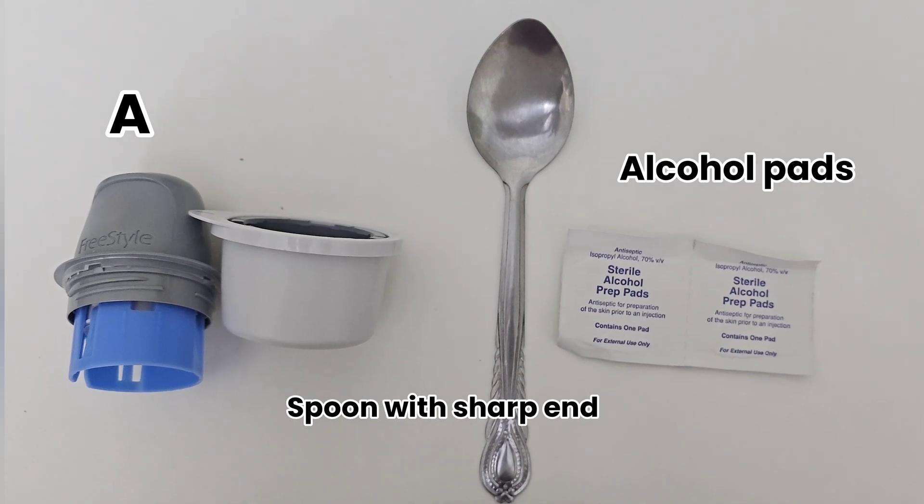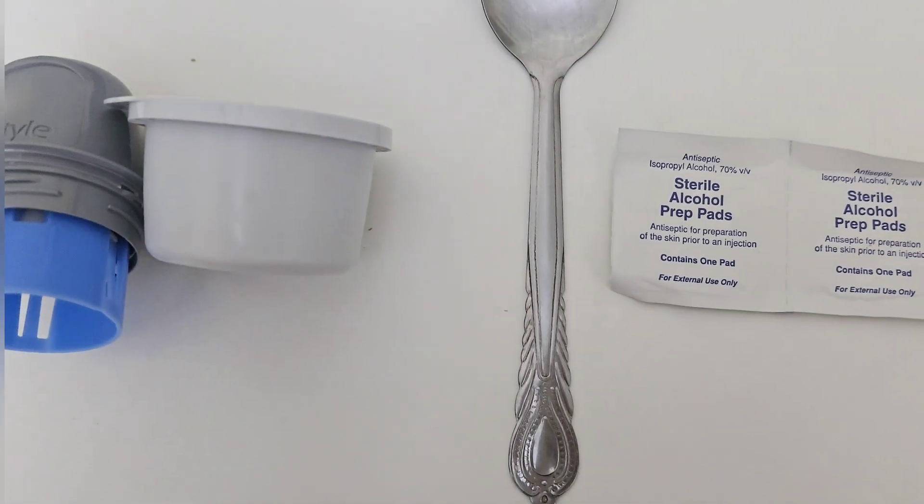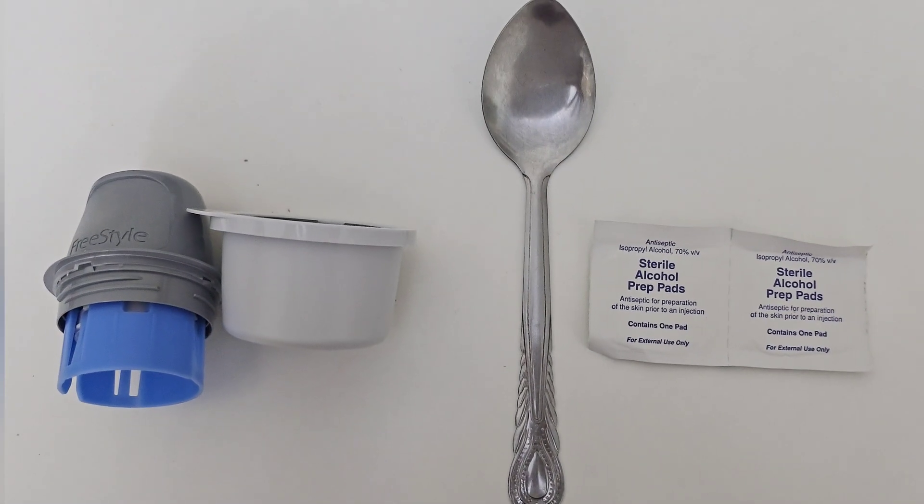All you need to keep the sensor in place are alcohol pads and a spoon with a sharp end. You can use any similar item with a sharp end like this.